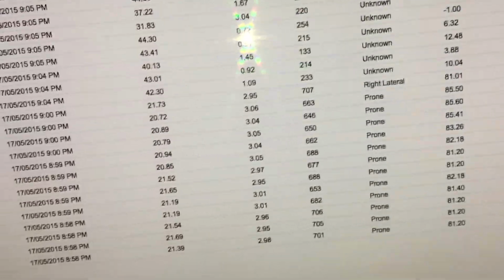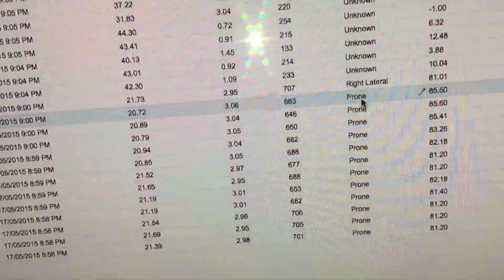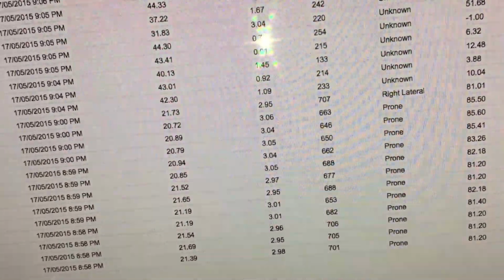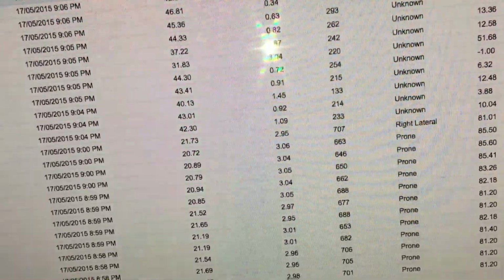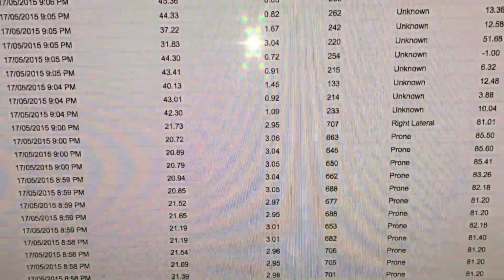You can see that at some stage, as I mentioned, I was able to move the body sensor around. The ECG is obviously going fabulous. I would assume so. I have no idea what the readings are, but that's what it is.